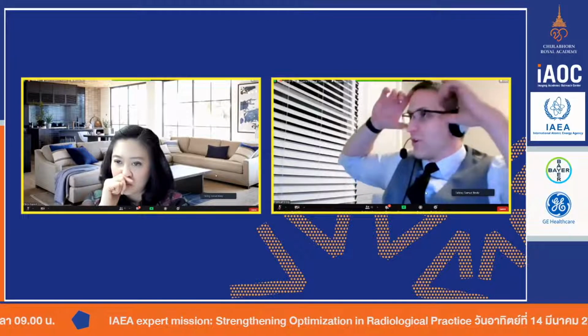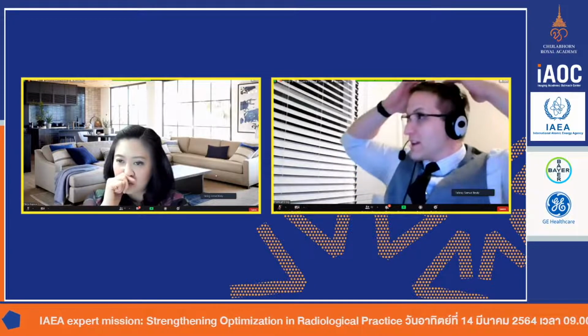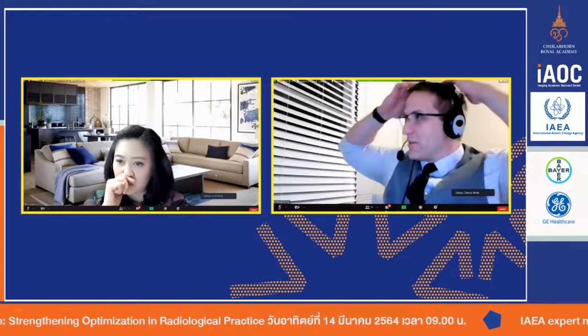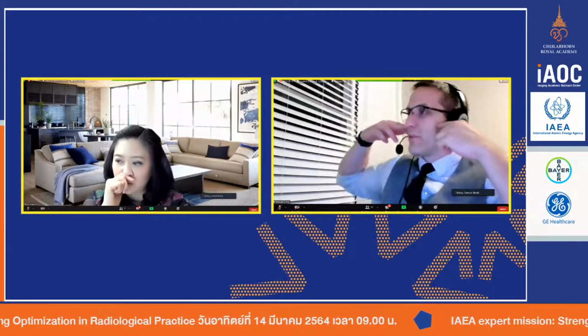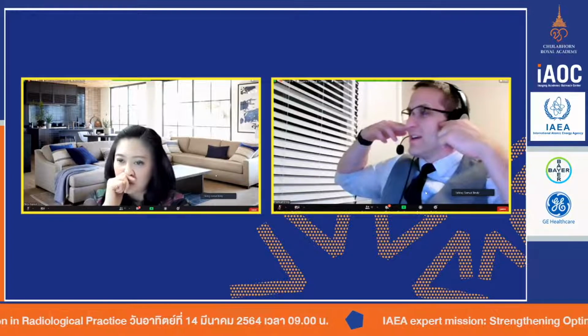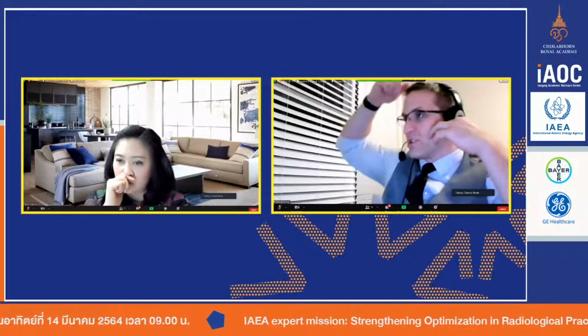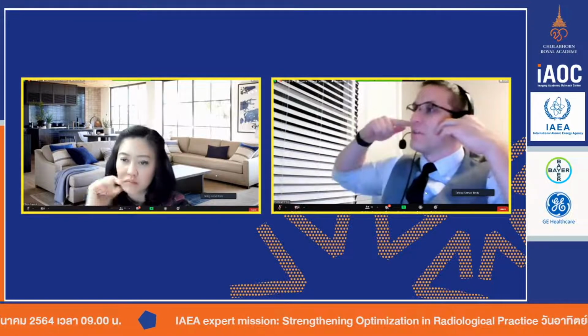So if I'm using a large scan field of view that's going from the upper apex of my cranium down through my eyes, past my orbits, then the auto MA is going to change quite a bit from the top down to the bottom here.